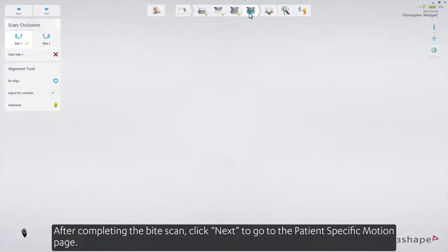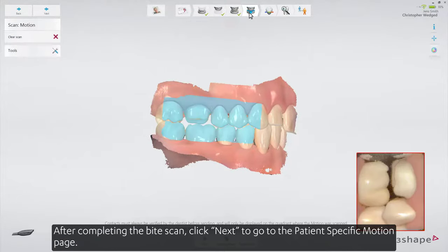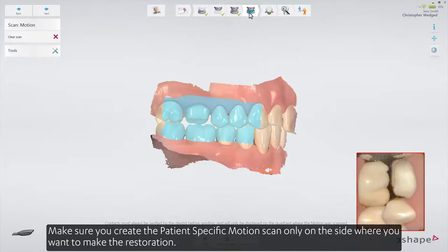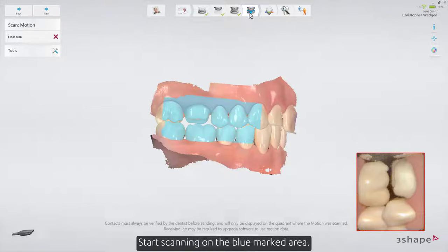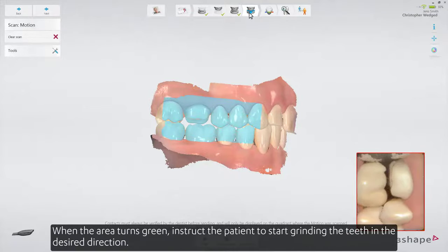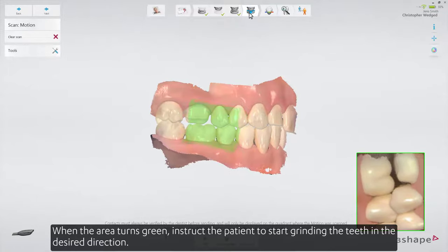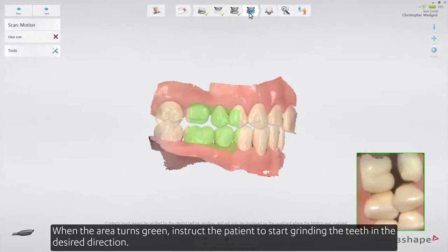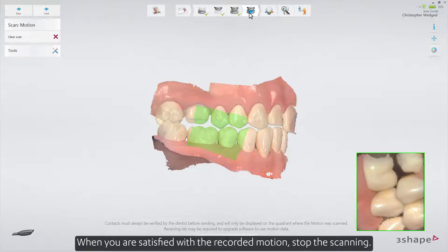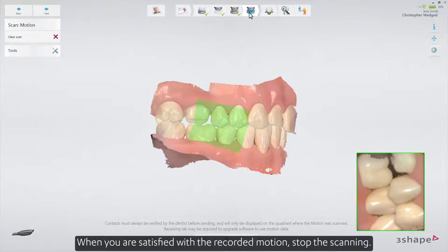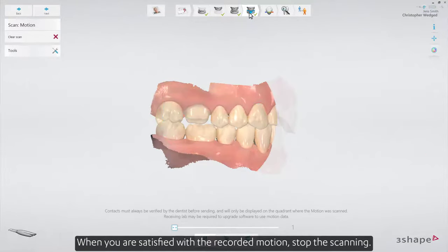After completing the bite scan, click Next to go to the patient-specific motion page. Make sure you create the patient-specific motion scan only on the side where you want to make the restoration. Start scanning on the blue marked areas. When the area turns green, instruct the patient to start grinding the teeth in the desired direction. When you are satisfied with the recorded motion, stop the scanning.